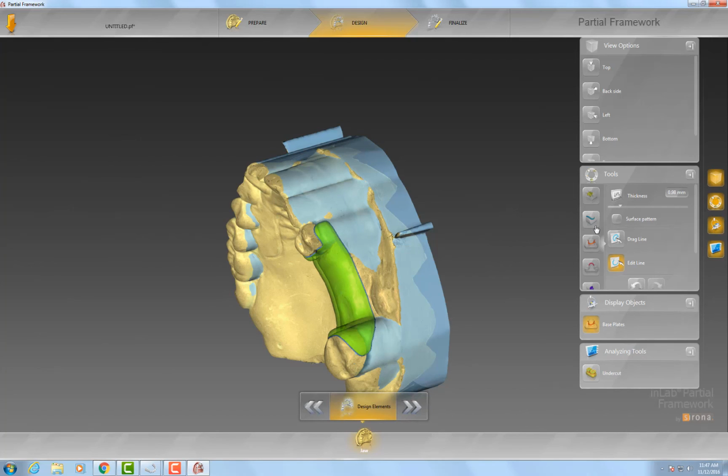That was a huge advantage to us due to the fact that we don't have to reset anything. We don't have to do another base plate. We don't have to do anything else. All we do is what the doctor made in-house is what we process immediately. So we are guaranteed a perfect fit every single time.